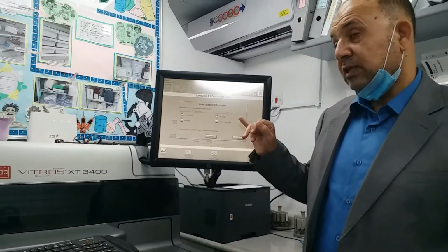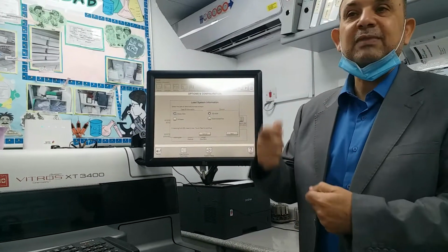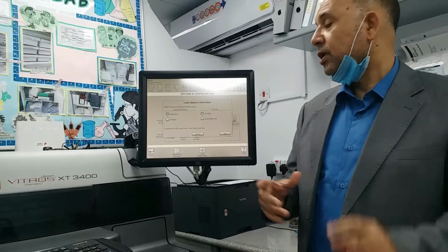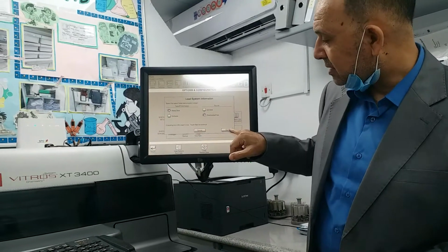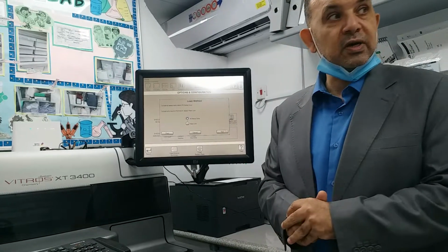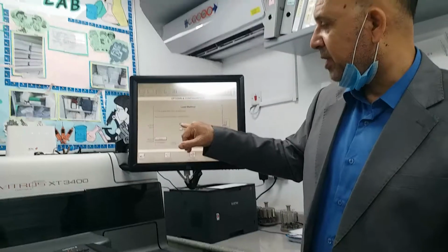Okay. Now, the one you want to load, is it from the download data or from the CD? If you have a CD, use that; otherwise, from download. So I'll keep it here on download. Next to that, I say next. Now the machine is verifying whether any file has been downloaded or not.